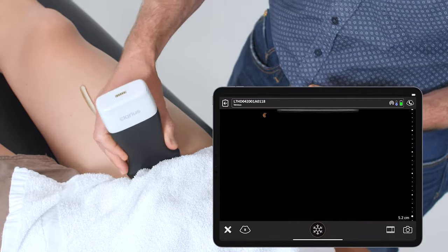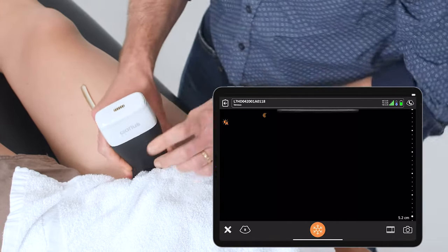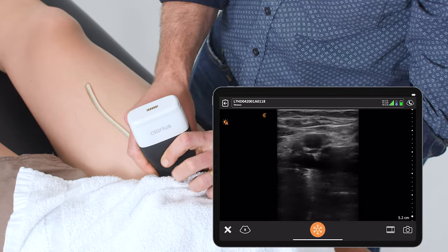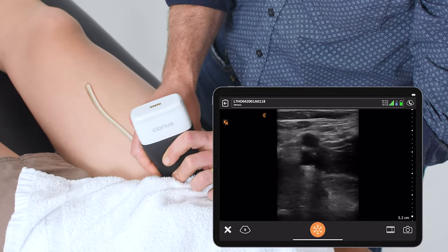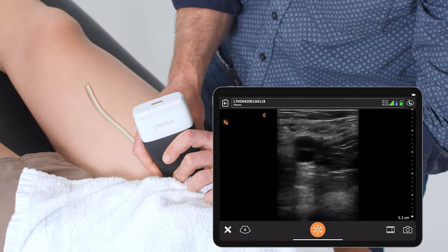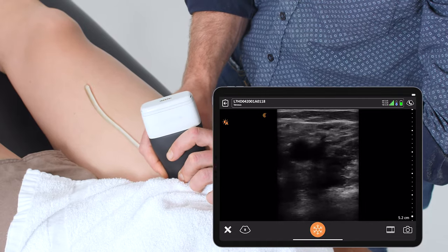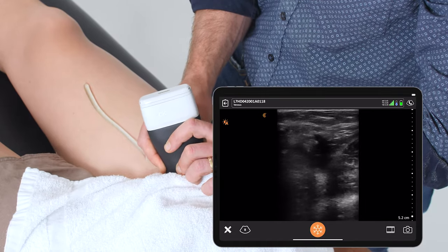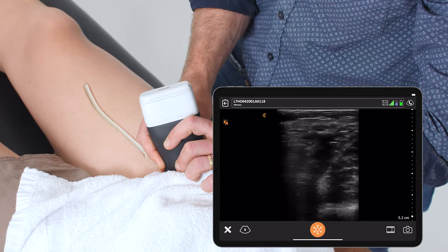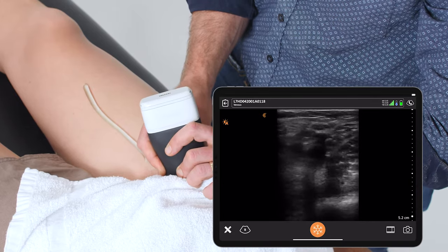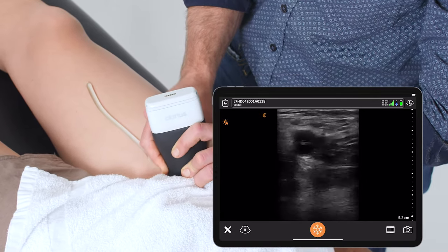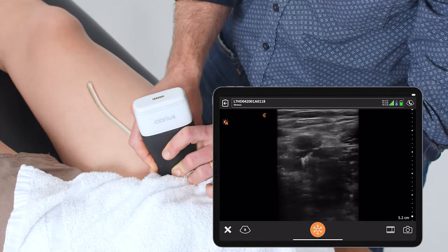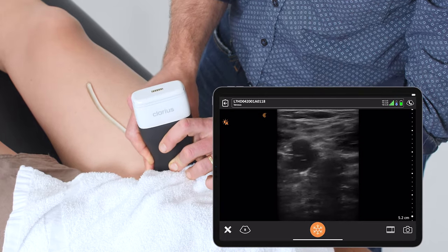I'm going to start my scan proximally at the common femoral vein, identifying the common femoral vein next to the common femoral artery, and making sure I identify the saphenous takeoff. Once I've seen the saphenous vein and the takeoff, I'm going to start compression, making sure that the anterior and posterior walls of the vein completely collapse.